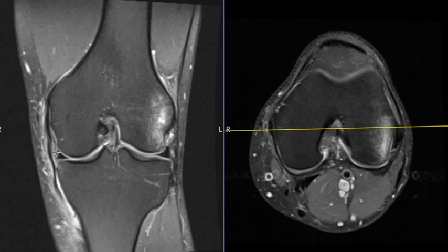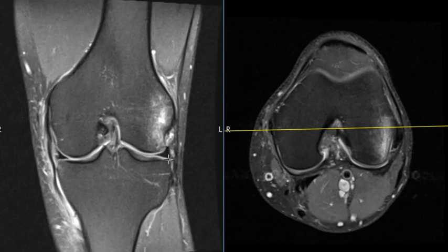The medial meniscus is adherent to this structure — this is the medial collateral ligament. Normally these are really closely approximated; they kind of stick together with no separation. But in this case we see that the peripheral rim of the meniscus is kind of jagged and irregular, as compared to the other side where it's clean. There's also brightness between the medial collateral ligament and the meniscus.